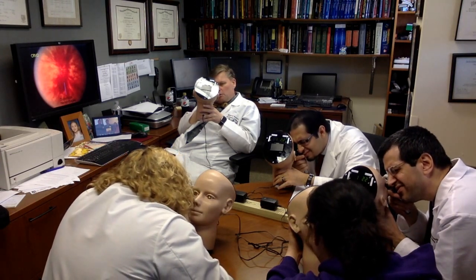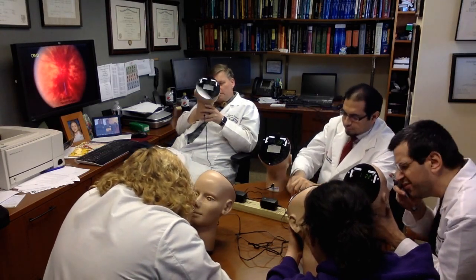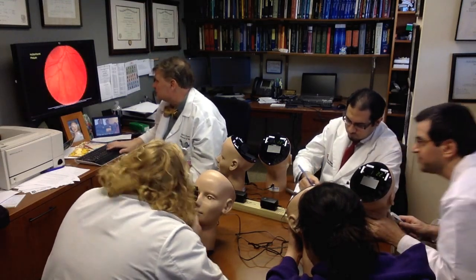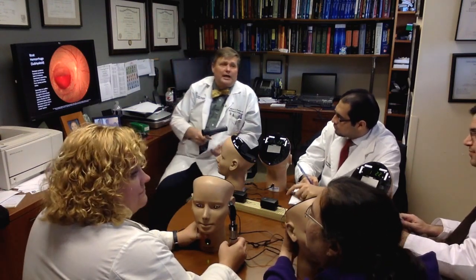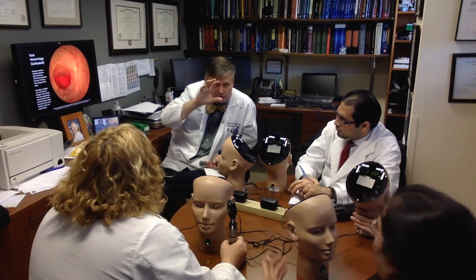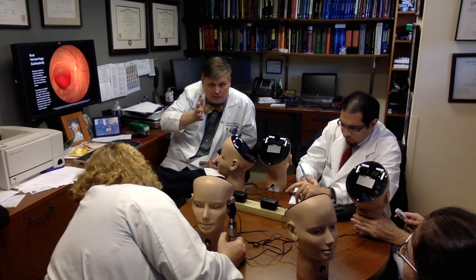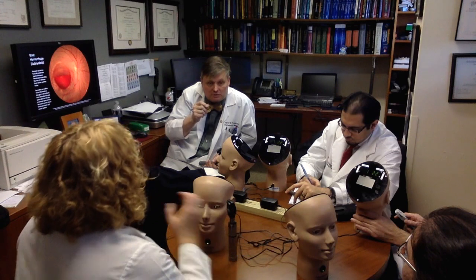That's a red boat. What do you think this is caused by? Subhyaloid. This is a subhyaloid hemorrhage caused by? SAH. Exactly, that's exactly right. Okay, so let's go back. This is a boat hemorrhage. The story is the globe is filled by the vitreous. The back of the vitreous is the hyaloid membrane, which is very thin and right on top of the retina. If you get a sudden change in intracranial pressure, you will often bleed there.